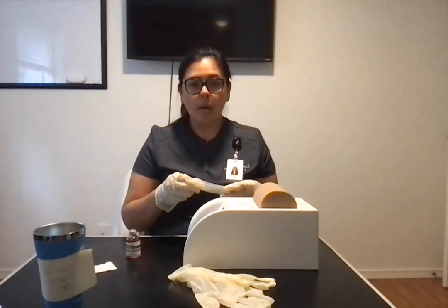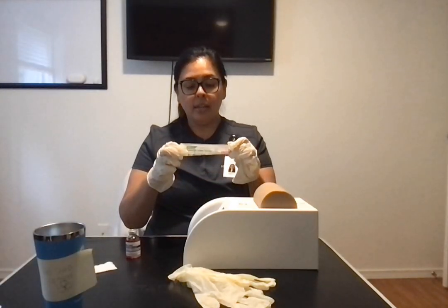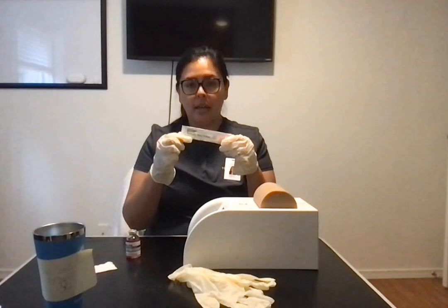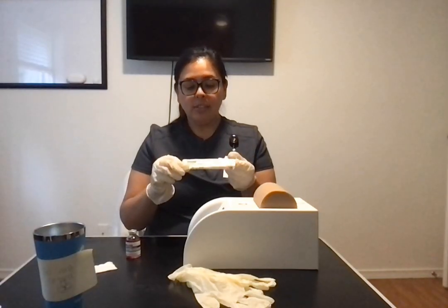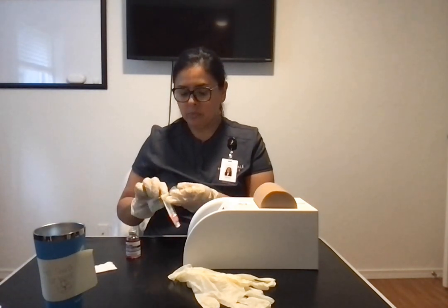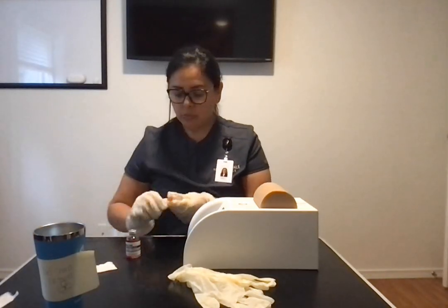Next, we're going to draw up the medication. So this, I have, it's given to us already. So it's a 1 ml syringe with a 25 gauge needle, and the length of the needle is 5/8. So I'll go ahead and open this up. Put that in the trash.